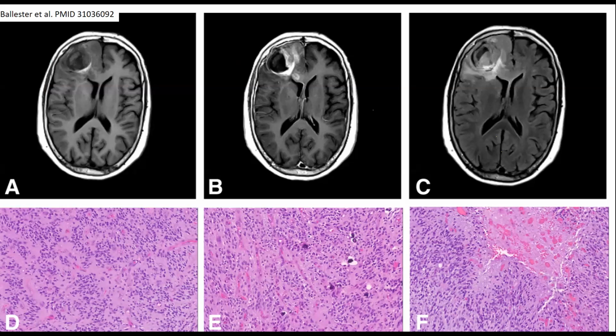And look at the histology panels below. Far left, you see perivascular pseudorosettes. In the middle panel, you get the pseudorosettes and the microcalcifications. This was a grade 4 tumor. You can see the necrosis and pseudopalisading. And if we go back to that middle panel, you can appreciate, even though it's a small image, the perinuclear halos, the oligo-like feature. And this is, again, not present in every FGFR-TACC3 fusion glioma, but it's highly characteristic.